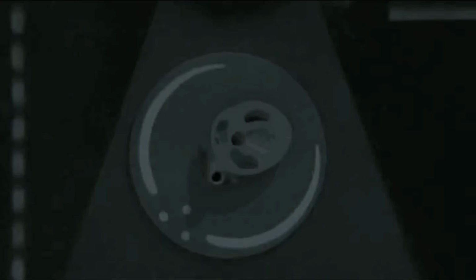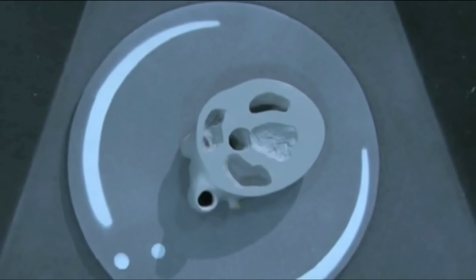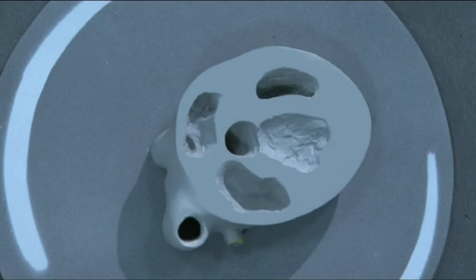When you move up the aorta, you'll see that very rapidly, as we saw in the earlier illustration, it turns the corner and starts to come up towards the fetal head. Therefore, what was a structure looking like a tube now becomes a circular structure as it is cut in cross-section.